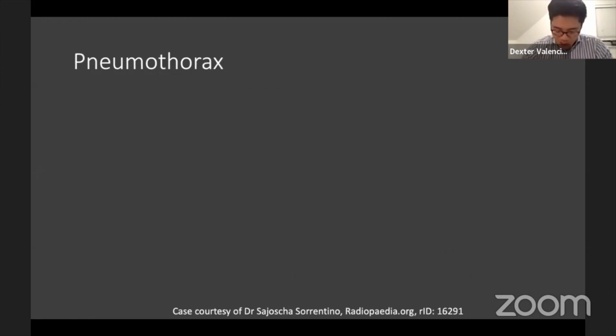I have a question from Rajan saying, what does ground glass nodules indicate? Malignancy, infection. Like with anything in medicine or radiology, an appearance can mean several things, and there's a very long list of causes for ground glass, and that's a talk in itself. It can mean aspiration, infection, heart failure, malignancy. That's what radiology training will teach you as you see more and more. It depends on where it is anatomically, the context, and any other features.